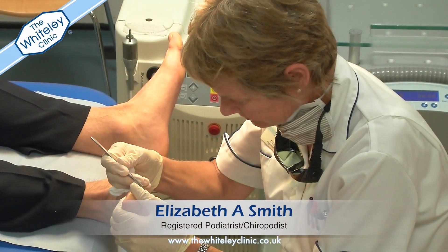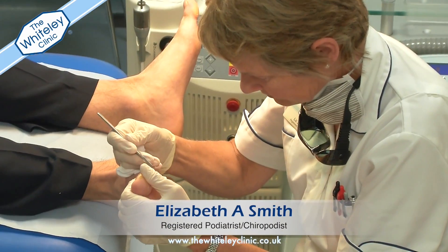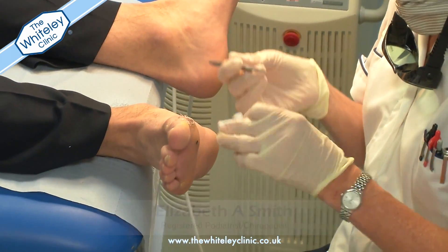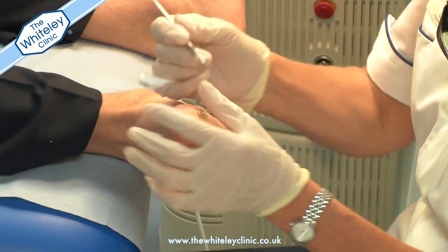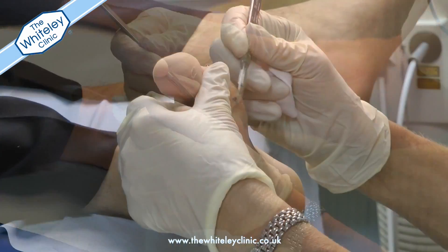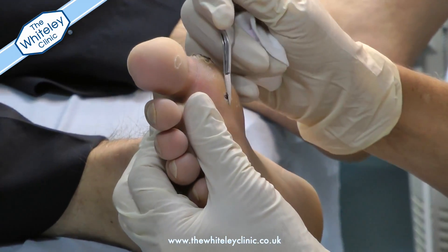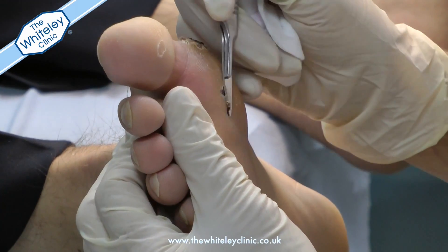Hi, my name is Liz Smith and I am the podiatrist at the Whiteley Clinic here in Guildford. My specialist area is treating verrucas with laser. The use of laser helps to kill the human papillomavirus in the body which causes the verrucas in the first place.